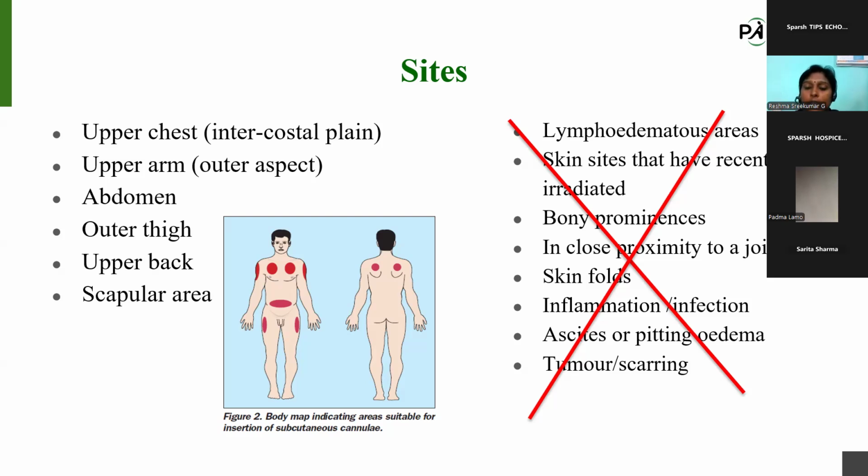We know in CA breast patients, most of the patients face complications like lymphedema. And in CA ovary, some patients may experience lower limb edema. So if the patient has a lymphedematous area, we do not allow any venipuncture there. Likewise, if the patient's hand is edematous or lymphedematous, we will not choose that area for subcutaneous infusion.